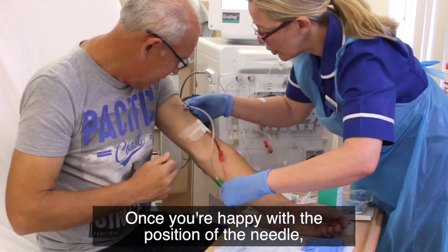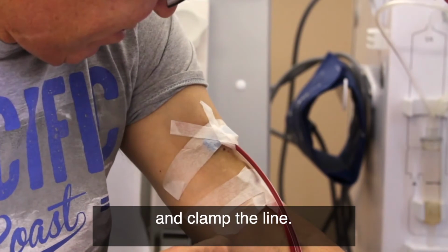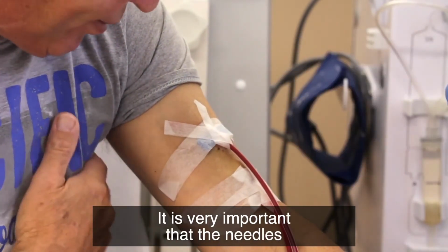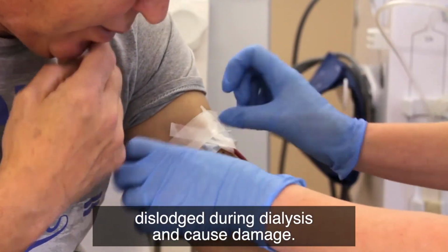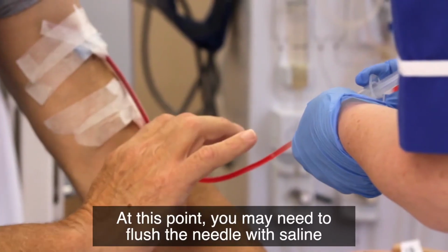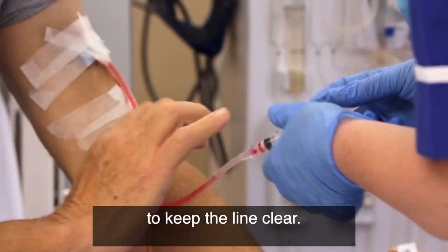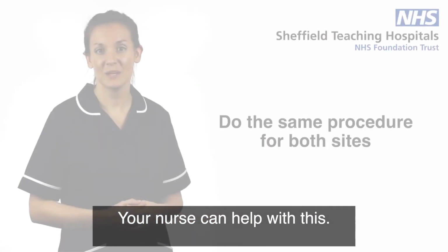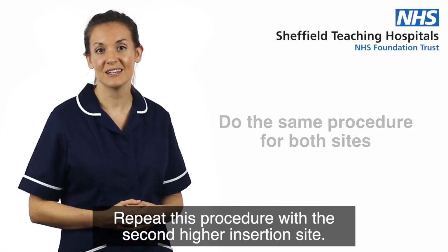Once you're happy with the position of the needle, secure the needle wings as you've been taught and clamp the line. It is very important that the needles are secured so that they do not become dislodged during dialysis and cause damage. At this point, you may need to flush the needle with saline to keep the line clear. Your nurse can help with this. Repeat this procedure with the second, higher insertion site.